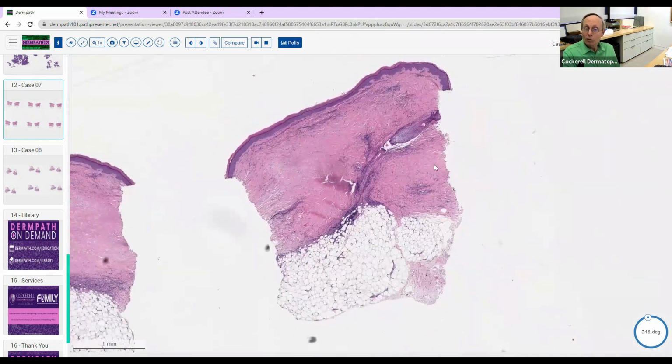And it also gives you that squared biopsy. So if you see a squared biopsy at low magnification, think, hey, that collagen is thicker than normal. Normally you take a biopsy, and because of the elastic fibers, it just contracts, and the epidermis gets thinner rather than staying the same thickness. So that boxy squared appearance makes you think that collagen is too thick, too sclerotic.